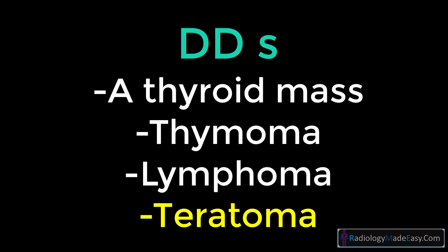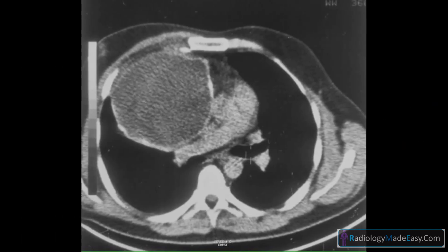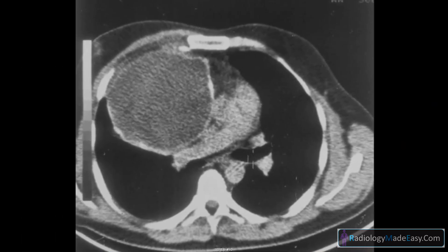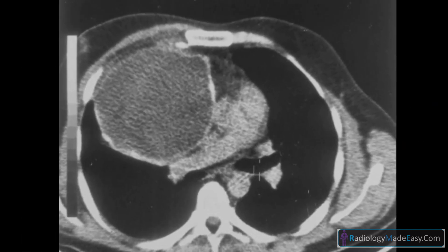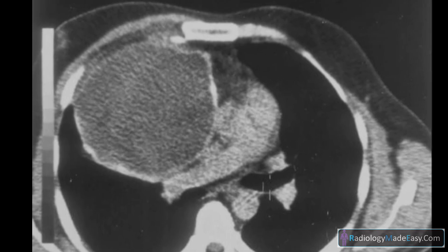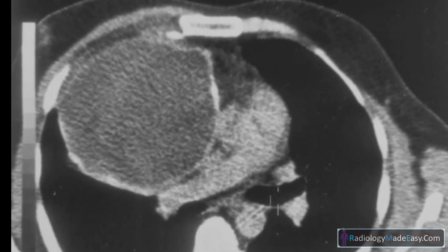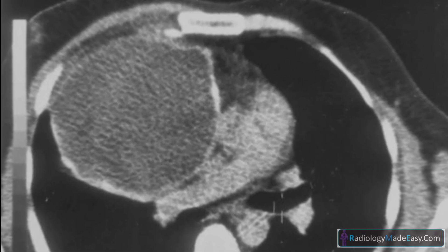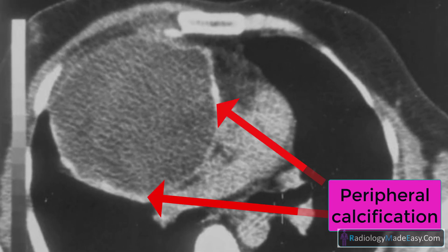The diagnosis in this case is an anterior mediastinal teratoma. This CT scan slice shows the mass with peripheral calcification, which is suggestive of a teratoma.